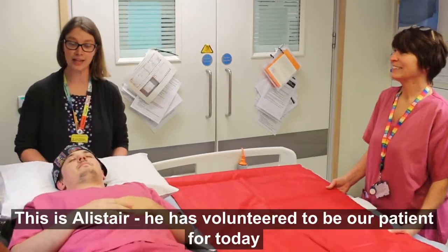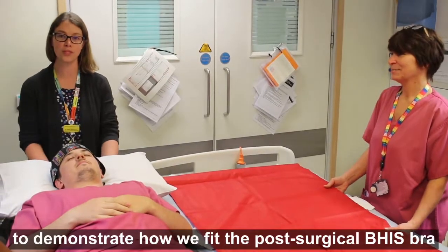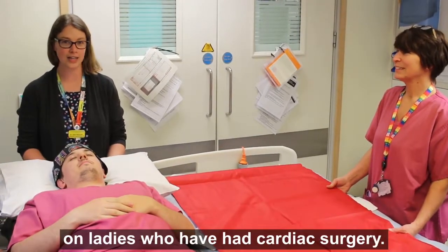This is Alistair. He has volunteered to be our patient today to demonstrate how we fit the post-surgical bra for ladies who have had cardiac surgery.